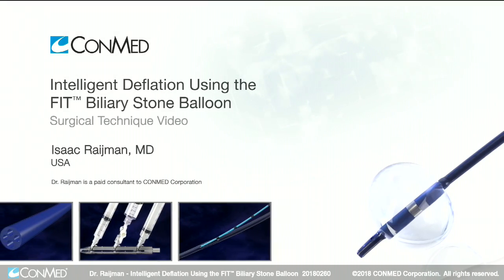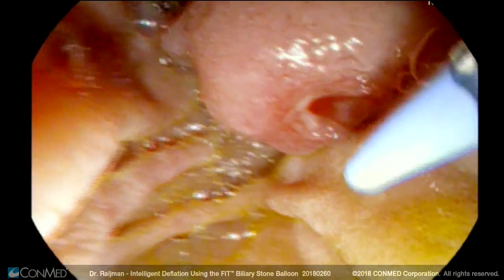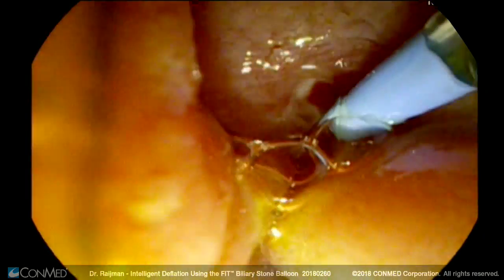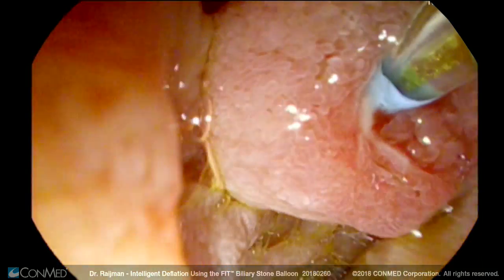The patient underwent a liver transplant last year and developed post-transplant jaundice a week or so after surgery. An ERCP was performed and a 7-French biliary stent was placed.